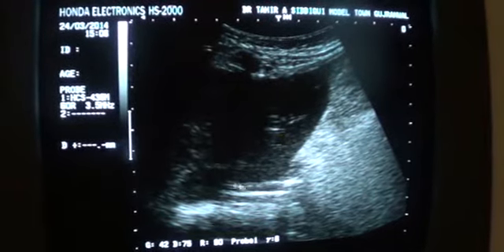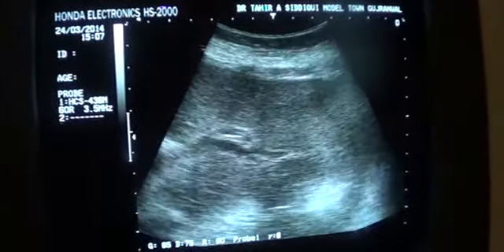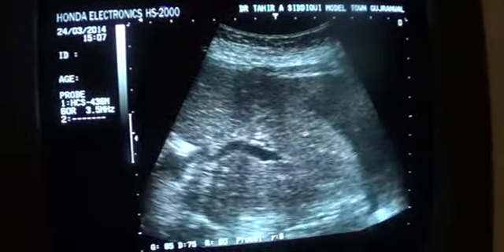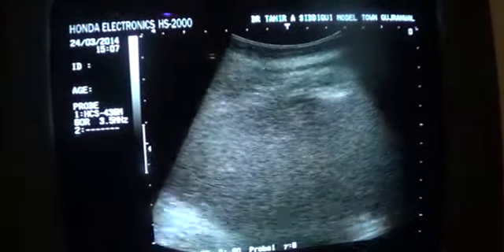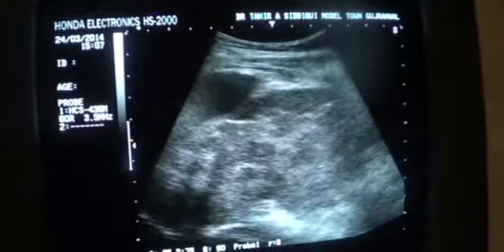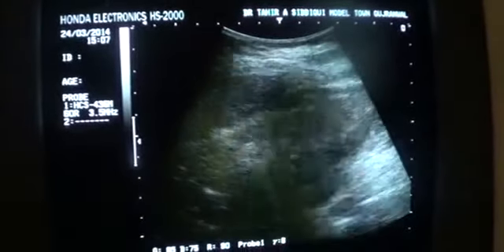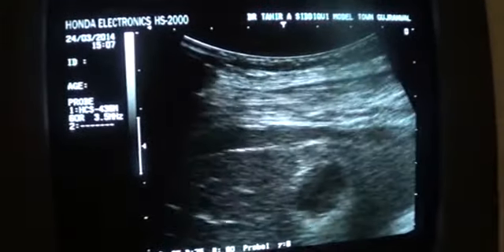This is the liver. You will see there is intrahepatic bile duct ectasia. Here you can see the bile ducts are dilated in the periphery and are seen more on the left side than on the right side, and the liver is seen below the costal margin, minimally enlarged. Within the liver you will see cystic areas surrounded by a dense coarse echogenic rim.